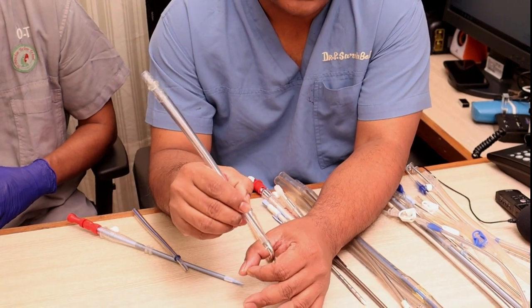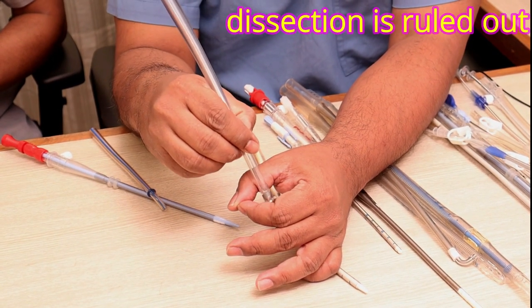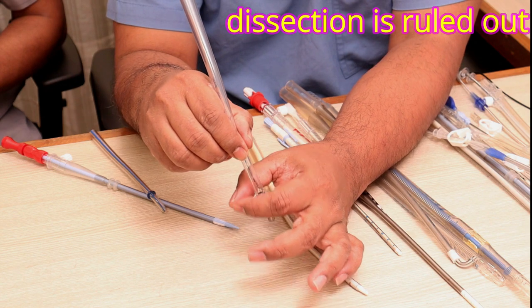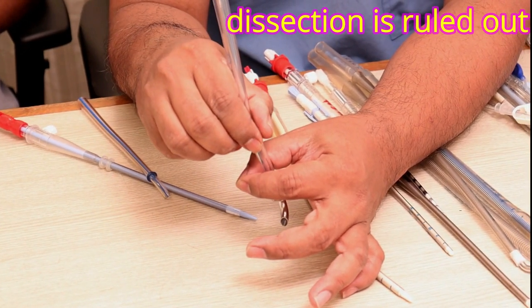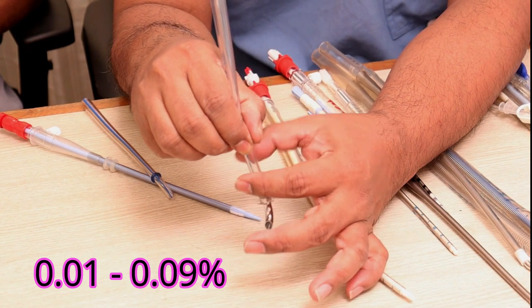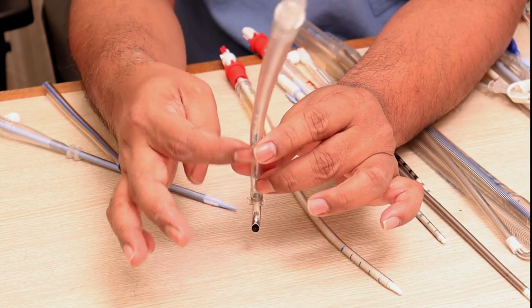The beveled edge is right-angled, so the insertion technique is: first direct the cannula towards the aortic valve, then turn it so the line faces the head end of the patient toward the anesthetist. If you can rotate the cannula after insertion, it confirms you are in the ascending aorta and effectively rules out dissection — the reported rate of which is approximately 0.003%. Once in the aorta, the flange is both hemostatic and helps secure the cannula with purse-string sutures. The line must face the anesthetist.